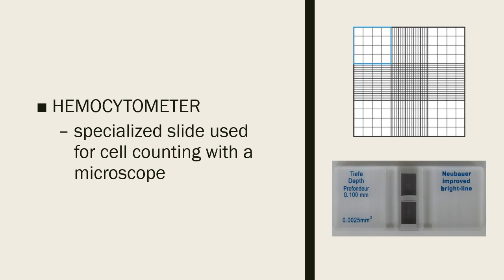And so, of course, how are you going to do this is you're going to charge your hemocytometer. And so the one illustrated here is an improved Neubauer hemocytometer. Okay, and so you're going to charge. And so that is why you need your WBC Thoma pipette, to dilute, to prepare a dilution of your sample.